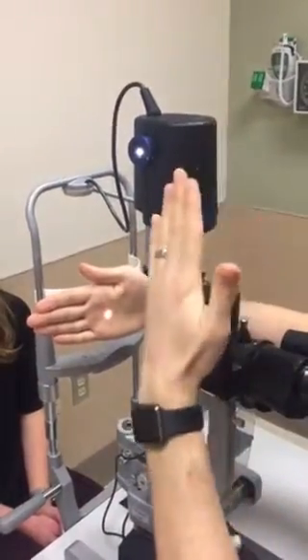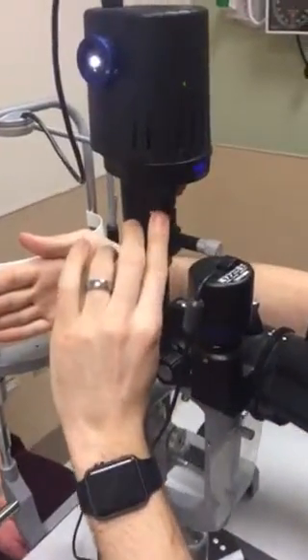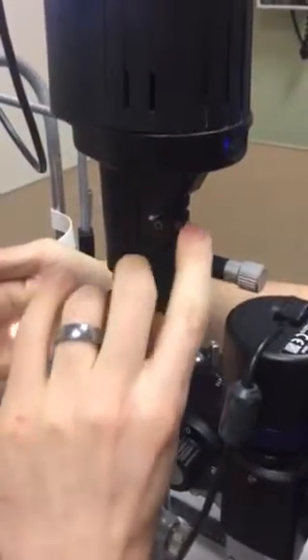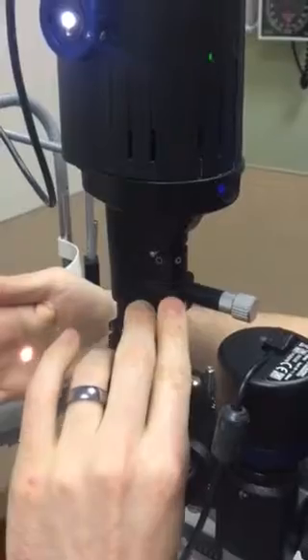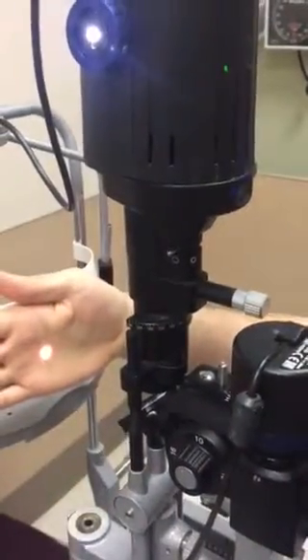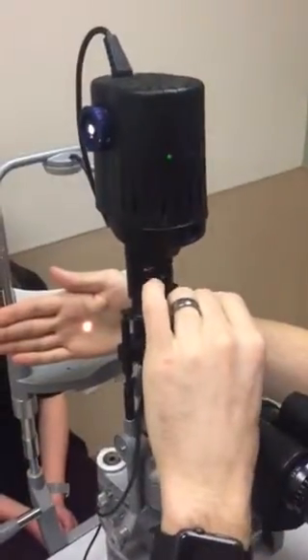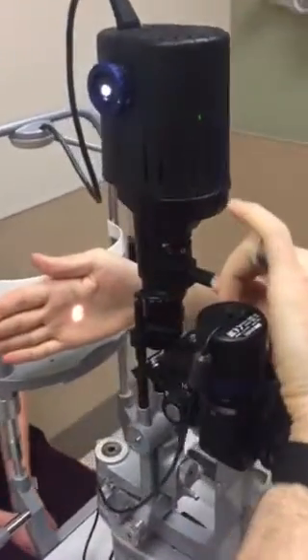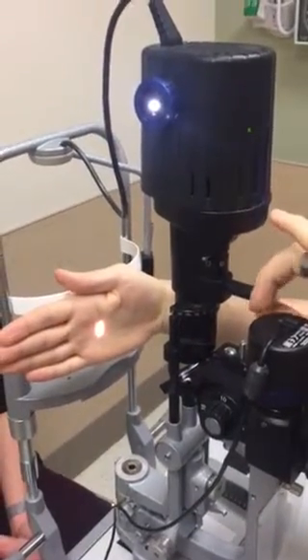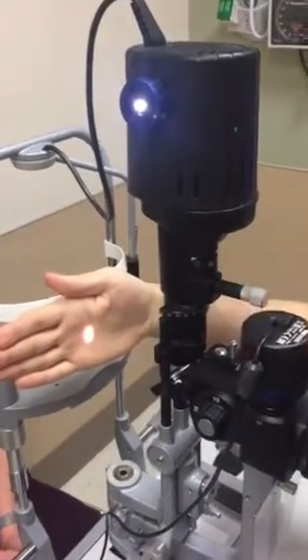So we've got the light source in the vertical axis. This is the filter lever — just have it all the way to the left, which is all the way open. There are some additional filters that ophthalmology uses, but for our purposes that's not really important. Here you have the slit lamp length and the blue light control. All the way to the left gives you blue light; one click right gives you white light. You'll obviously need blue light to use with your fluorescein, and white light for your regular exam.